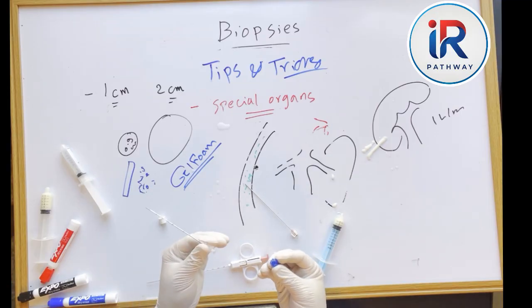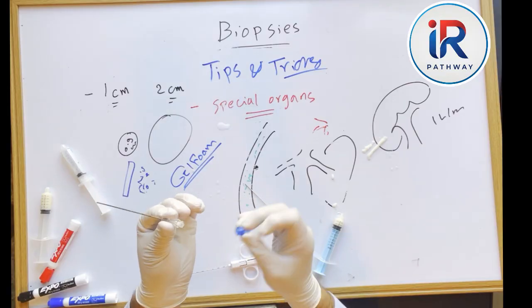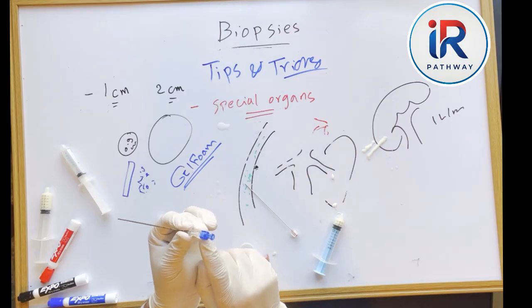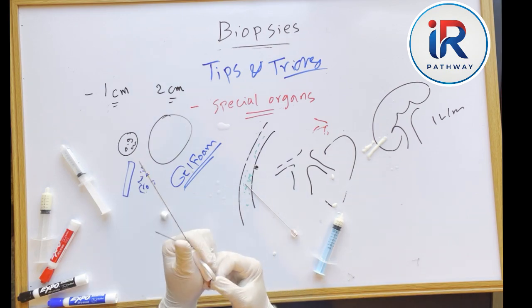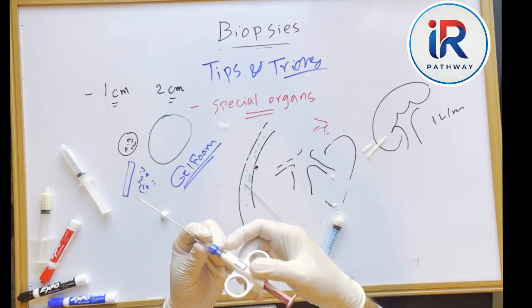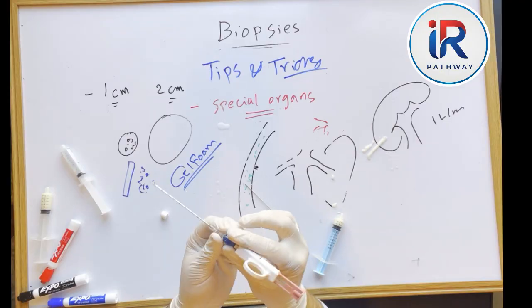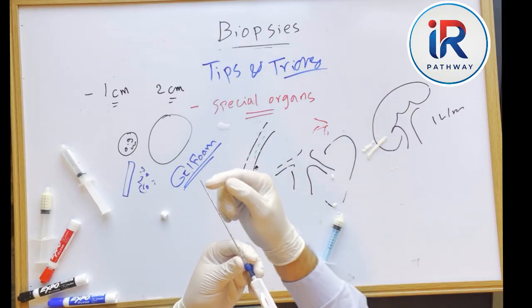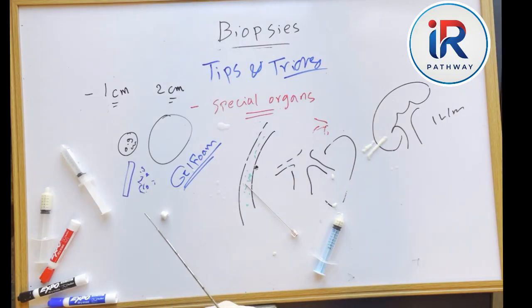This piece is 1 centimeter long, okay, and we attach it to the hub. So we effectively are adding an extra 1 centimeter here. Okay. So now if I set the needle to 2 centimeter and advance it to the hub, I'm actually hubbed with the blue piece. That means I'm still 1 centimeter away from the original needle hub. As a result, that extra 1 centimeter is subtracted from the notch here. So when I push this out, you can see that only 1 centimeter is exposed. There is still 1 centimeter inside.